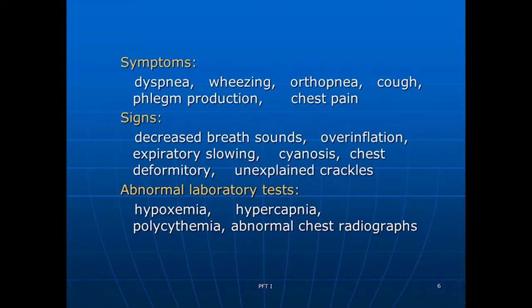So patients are going to come in, they're going to have trouble breathing. Sometimes they have dyspnea on exertion when they have physical activity, or sometimes it's just plain dyspnea when they're sitting. So this is probably the most common symptom that a patient comes in with, which gives an indication to say, well, let's do some pulmonary function tests on this particular patient to see why they're dyspneic.